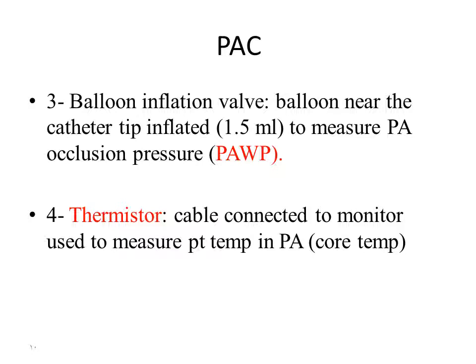بدل ما نعطي بالبروكسيمال لومن فلويد بنخليها فقط to measure the right atrial pressure وبنعطي الانفيوجن ب additional lumen وبالتالي صار عندنا 5 lumens. إذا أضفنا 2 additional lumens واحدة to assess the mixed venous O2 saturation وواحدة to measure the changes in the cardiac output and thermistor filament بنسميها 7 lumens. إذن هي عدة تصنيفات لكن same purposes.